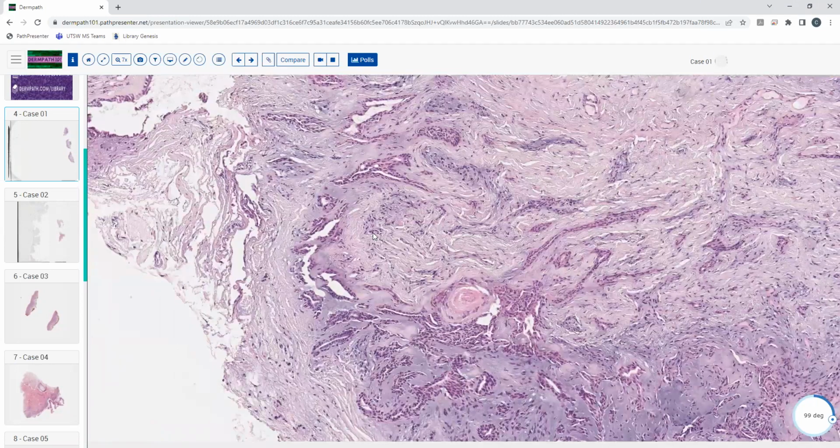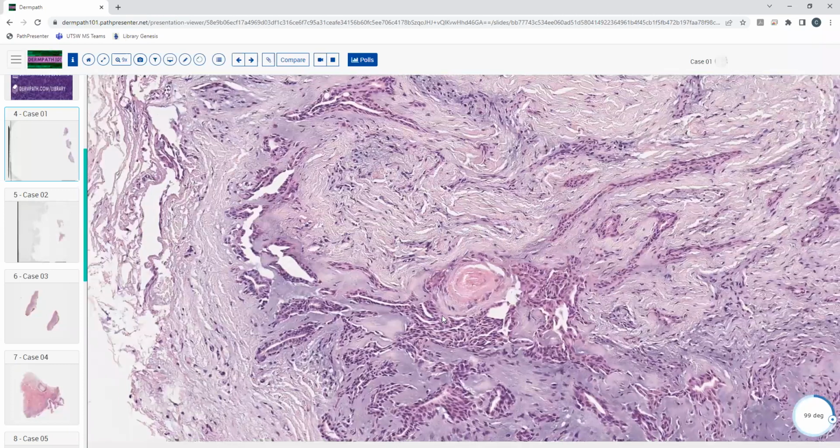I guess, well, I'm not an expert, but I started thinking, trying to differentiate if you're seeing it look more like follicular or sweat gland. So if you're seeing ducts and things like that, lean more towards sweat gland, and then what kind of stroma you're seeing.